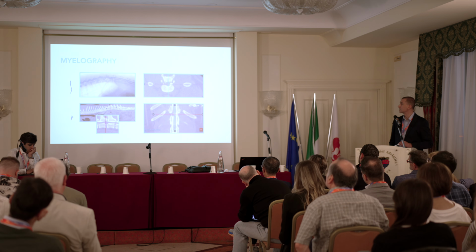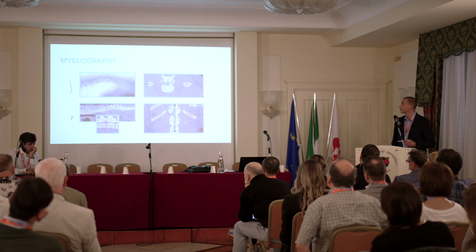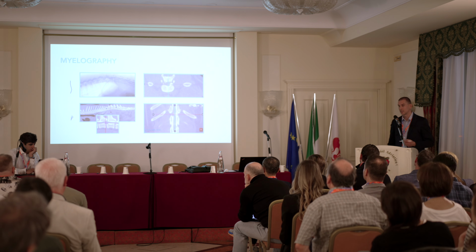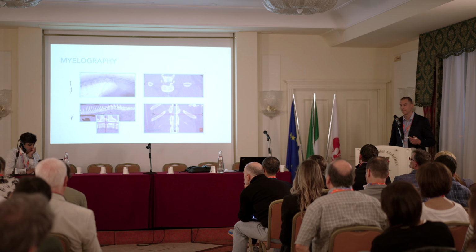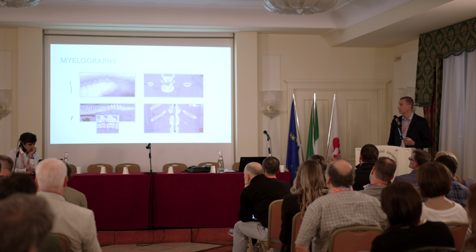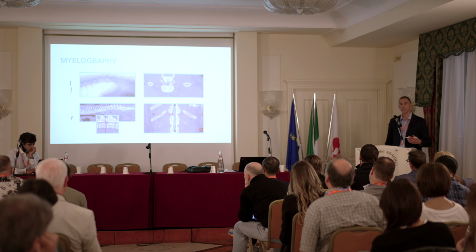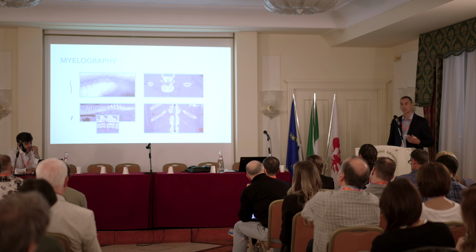You can see the same changes or the same abnormalities on the fluoro, on the myelo. So, okay, in this case, we could have a good diagnosis after fluoro, but to be honest, I want all images in all axes to check it, how is it looking.